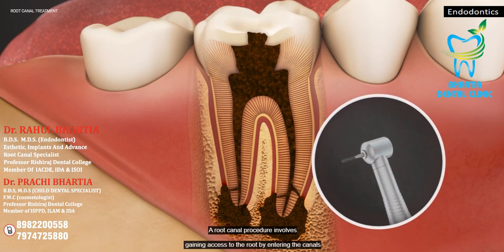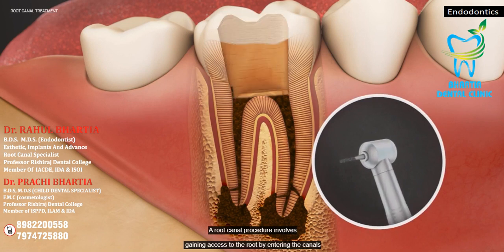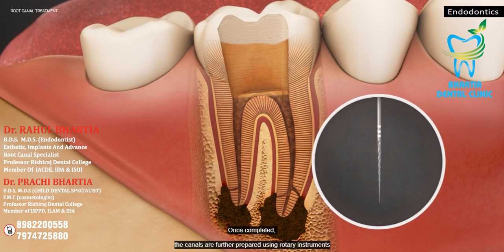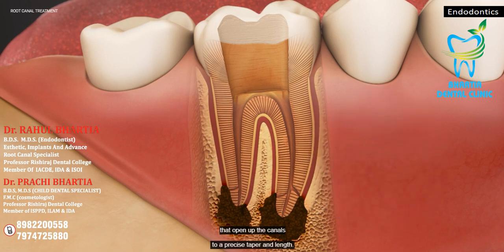A root canal procedure involves gaining access to the root by entering the canals from the crown of the affected tooth and removing all of the decayed tissue. Each tiny canal is then identified, cleaned, and disinfected using small, narrow instruments called files. Once completed, the canals are further prepared using rotary instruments that open up the canals to a precise taper and length. A flexible plastic material called gutta-percha is then used to fill each canal, sealing it and protecting it from damaging bacteria.